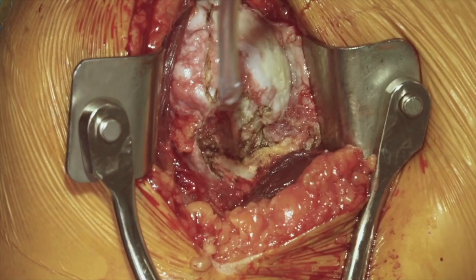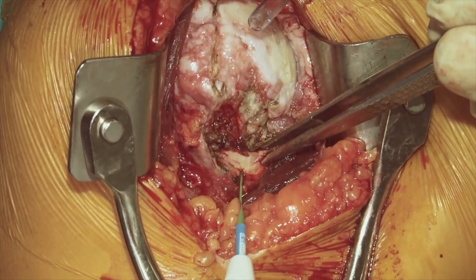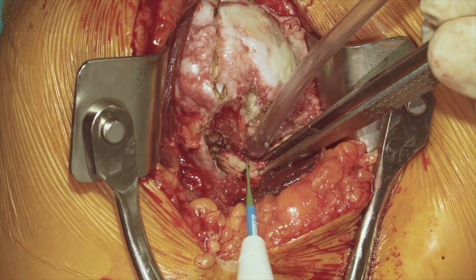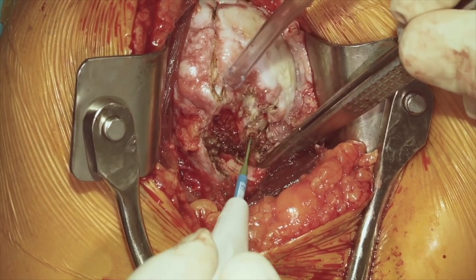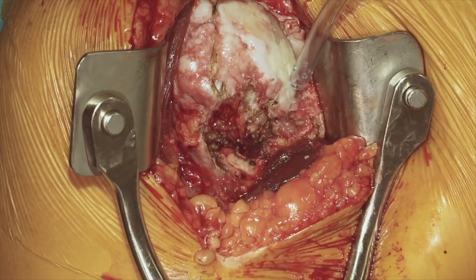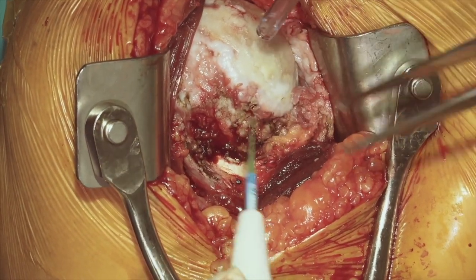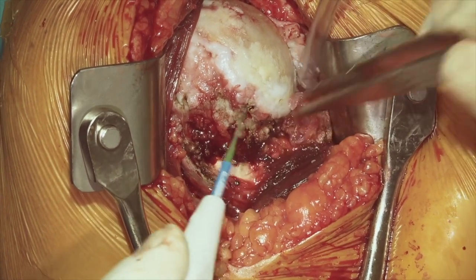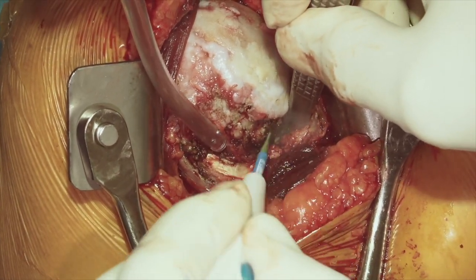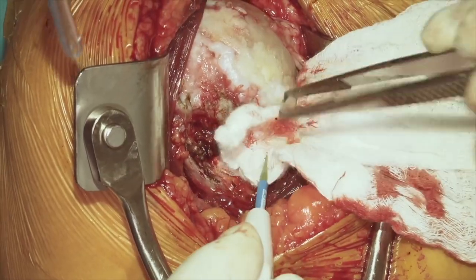We'll proceed inferiorly with our release and go down until we see the white fibers of the latissimus tendon, attached into the medial intertubercular ridge of the bicipital groove. Once we are at that distal extent, we can then continue to proceed more inferior and then posterior on the humerus to perform our release of the capsule. We always go to at least the six o'clock position on the humerus and further as necessary to get a nice release of the soft tissues.